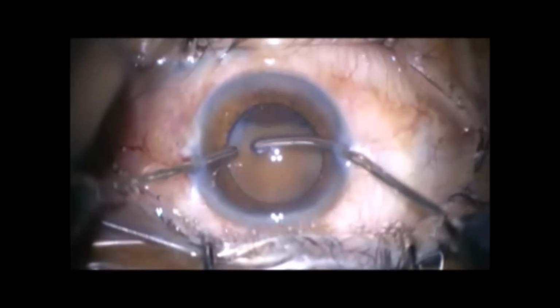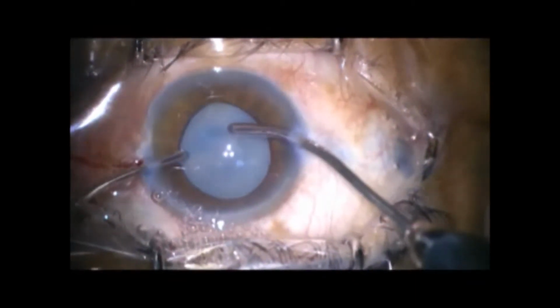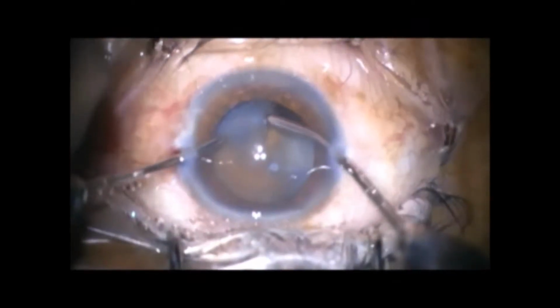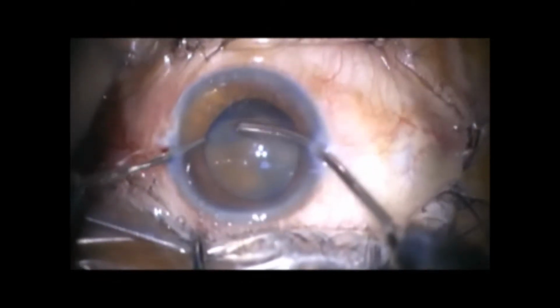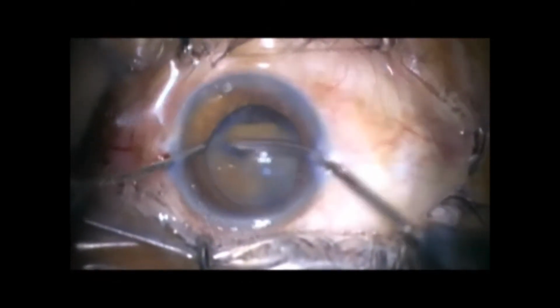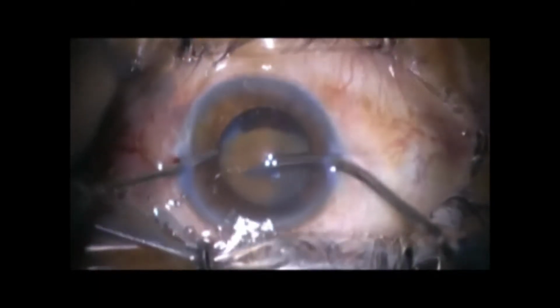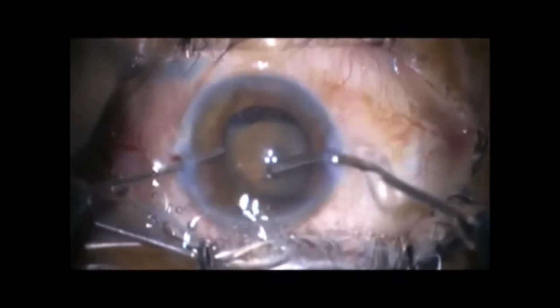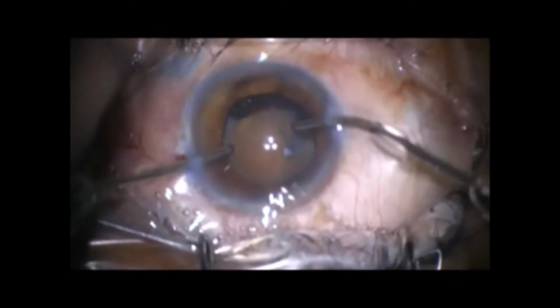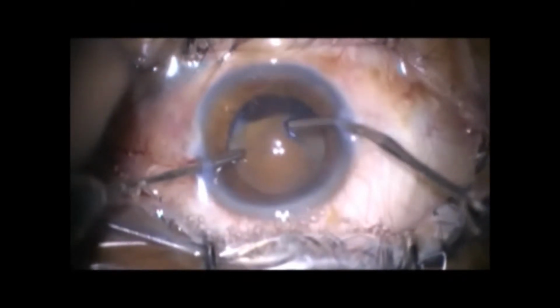One more thing that makes a regular continuous curvilinear capsulorhexis tricky in such cases is, after the aspiration of liquid cortex in the hypermature cataract, the bag becomes capacious. The cataractous lens is seen floating freely in the bag. Such a lens offers minimal or no support to the anterior capsule during regular CCC. In our technique, CCC is independent of that factor and can be performed successfully.